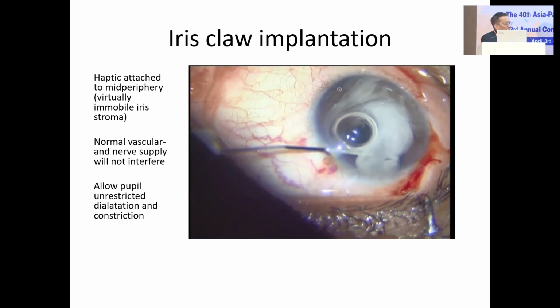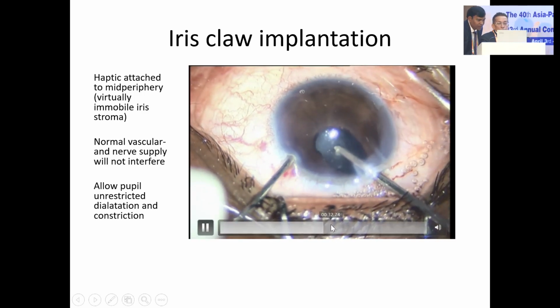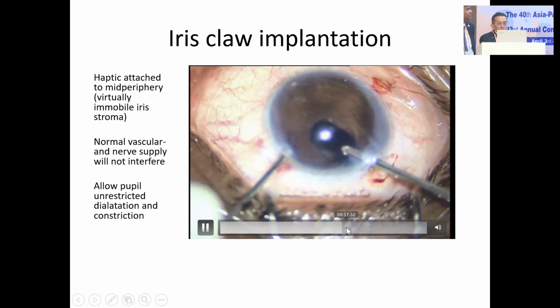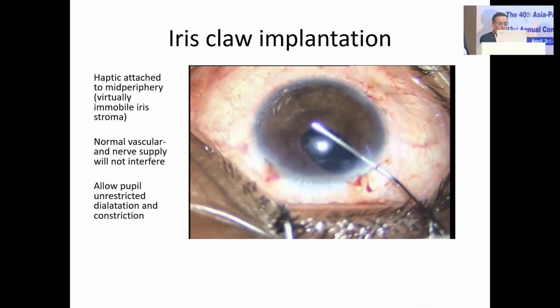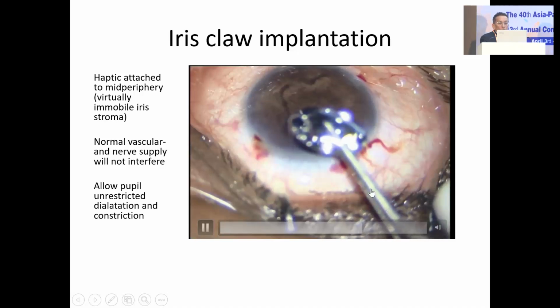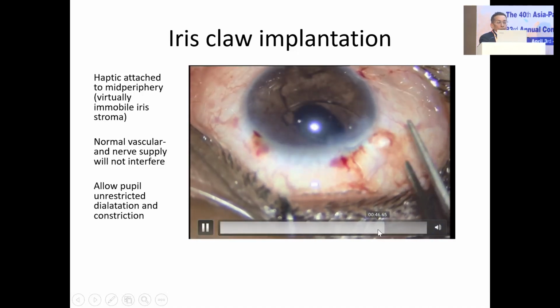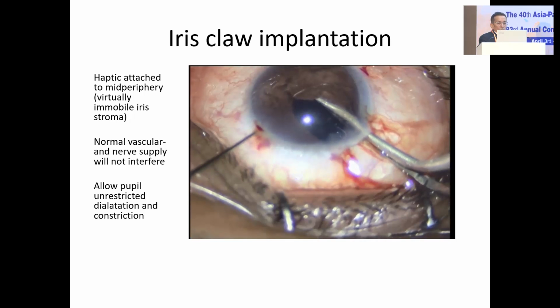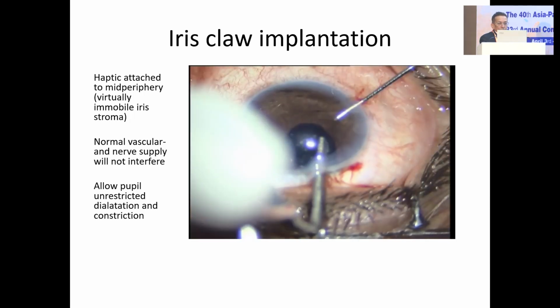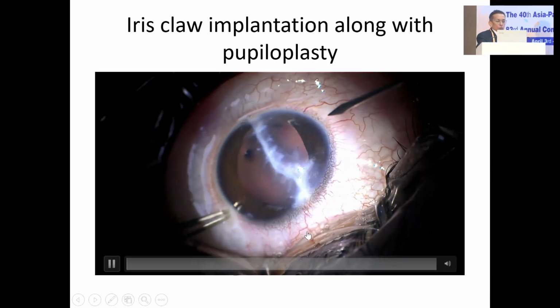Then the vitrectomy with the trocar, viscoelastic, and put in the iris claw.